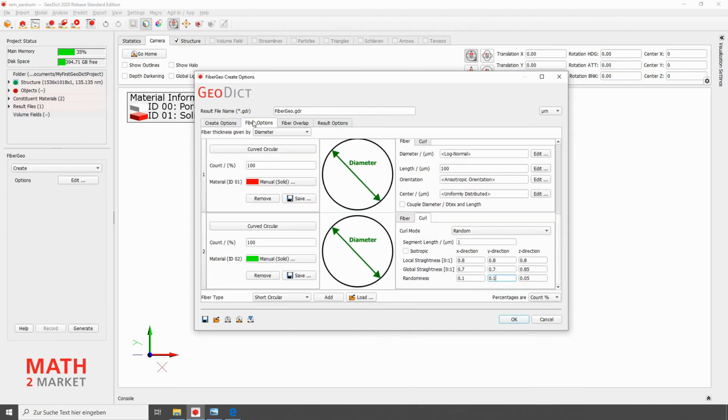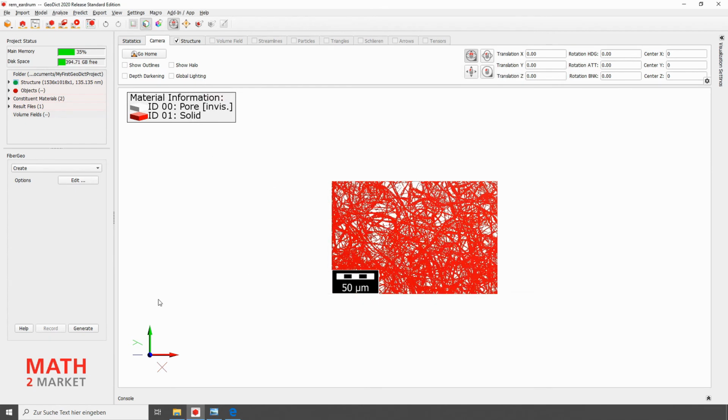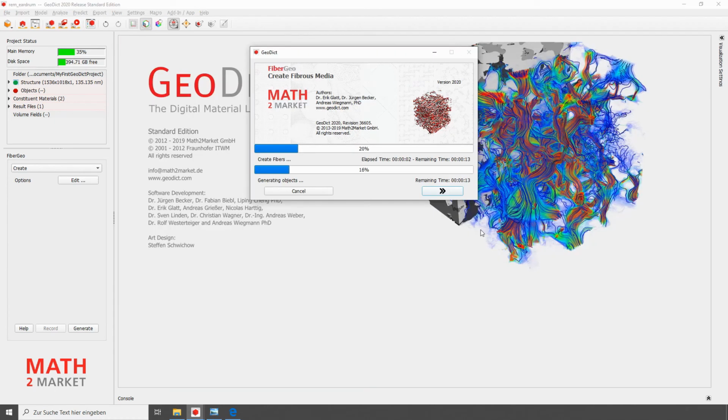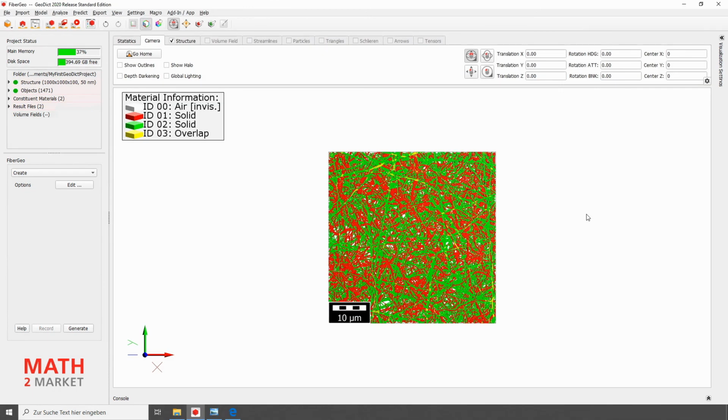GeoDict now asks us if we want to generate both fiber types in equal proportions. Yes, we do. Then we can click on Generate. Now GeoDict generates the fiber structure. Now we see the fiber structure in the GeoDict standard colors red and green.